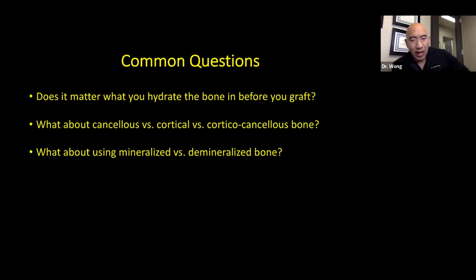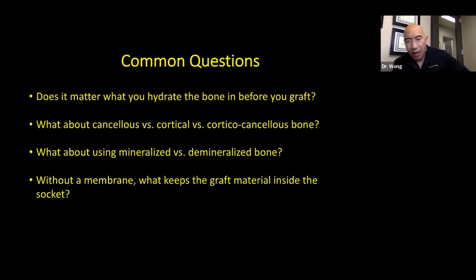You're going to use mineralized bone though. And the reason why you're going to use mineralized bone over demineralized bone is because it lasts longer. And with grafts for sized defects like sockets, you want something that lasts longer.